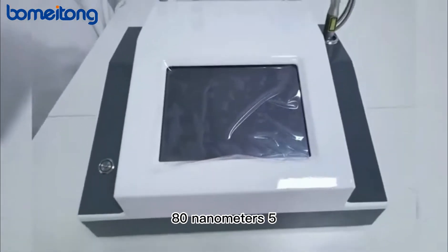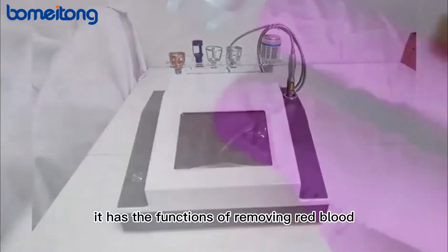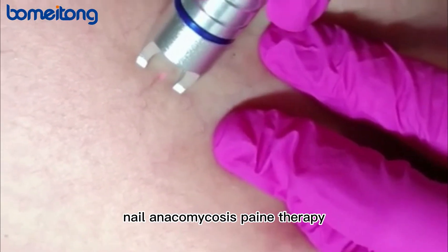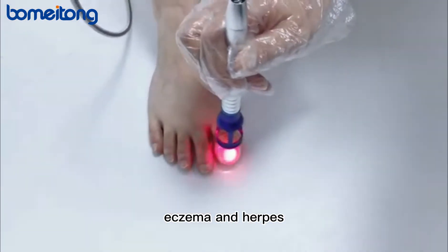This is a 980 nm 5-in-1 multifunction laser therapy device. It has the functions of removing red blood vessels, nail onychomycosis treatment, pain therapy, skin rejuvenation and anti-inflammatory, as well as eczema and herpes treatment.